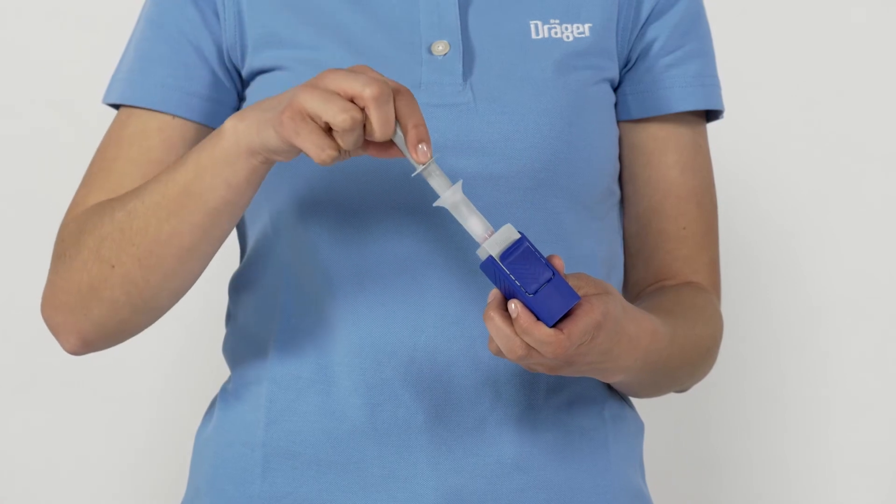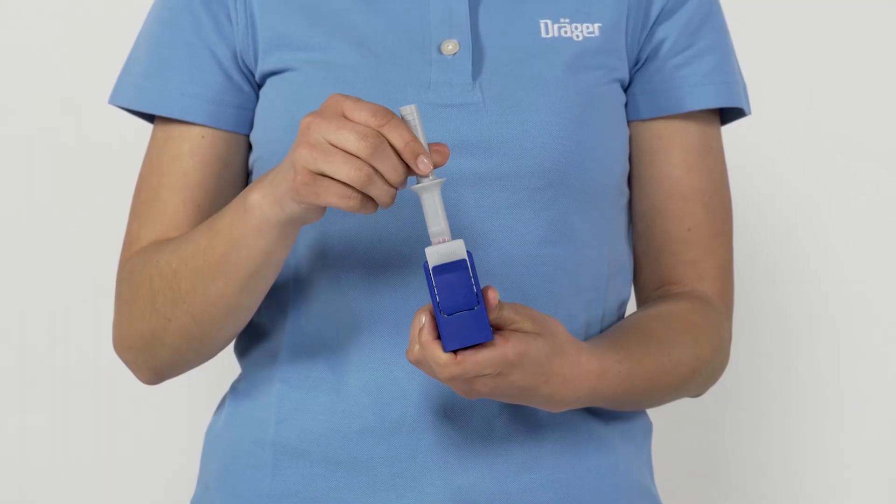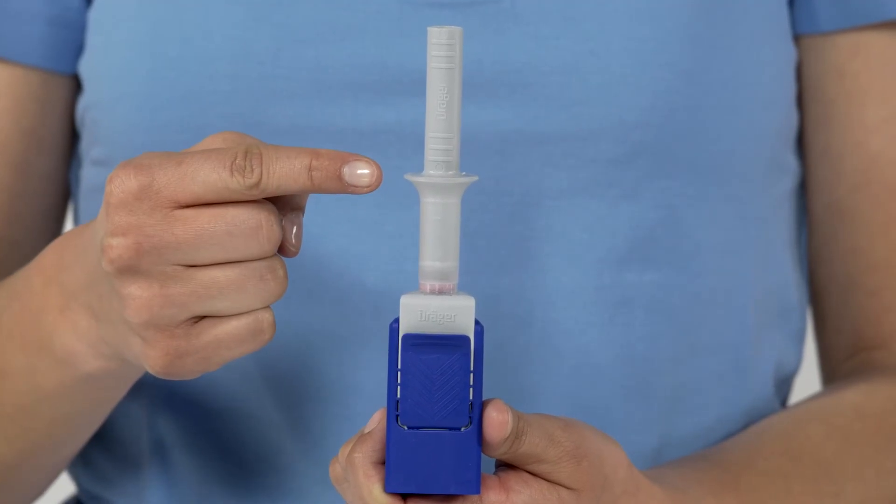Now push the sampler up to the stop into the funnel-shaped opening, so that the vial containing the buffer fluid in the test cassette breaks. There must be no gap between the sampler and the test cassette.